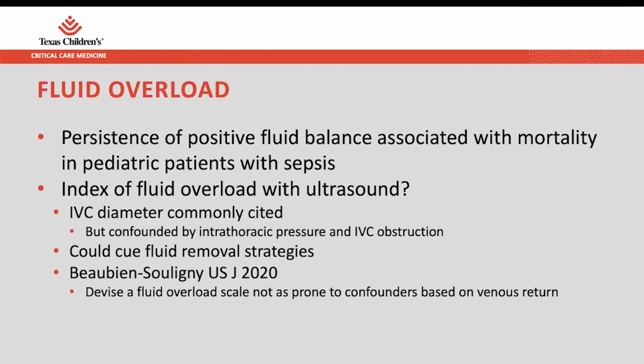So looking for other targets, we can always have ongoing interest in whether or not ultrasound can do that for us.